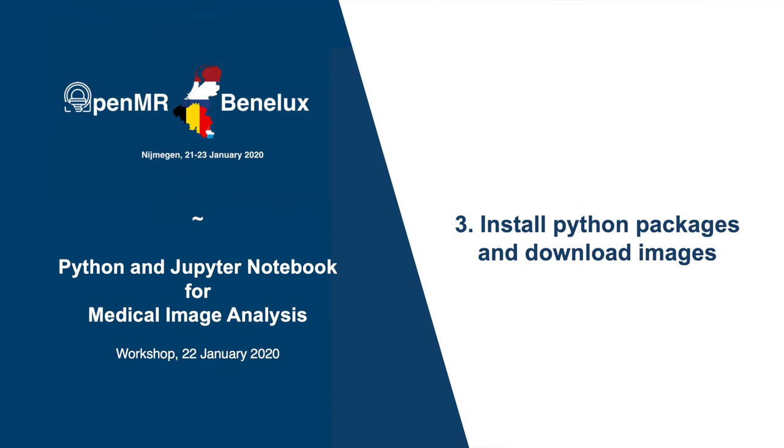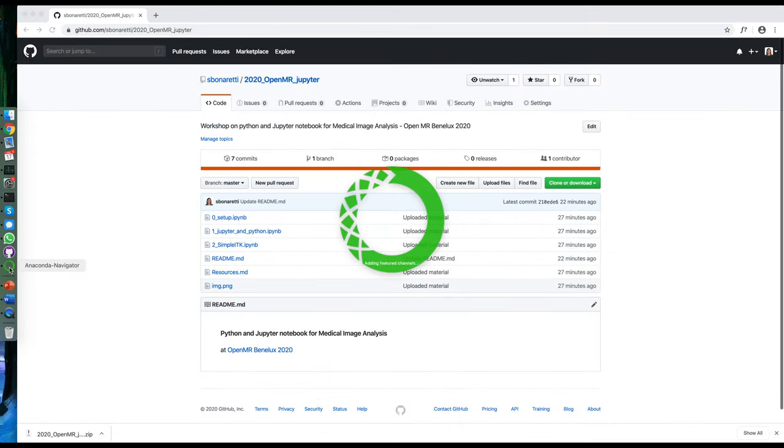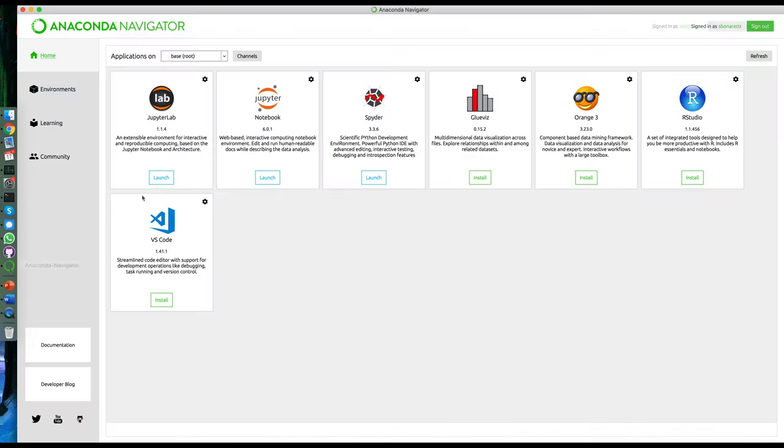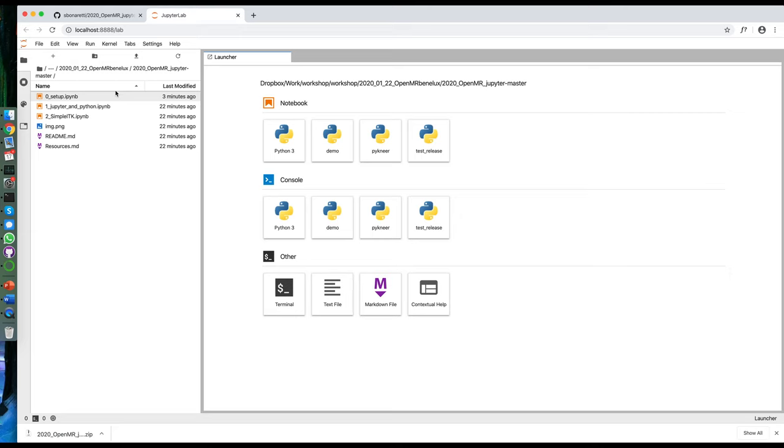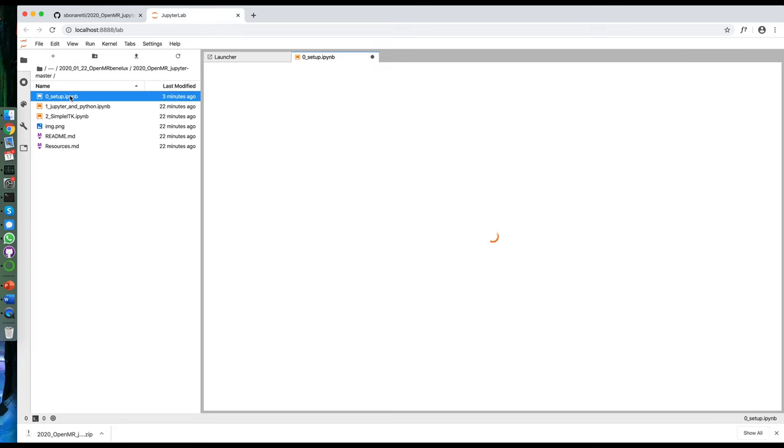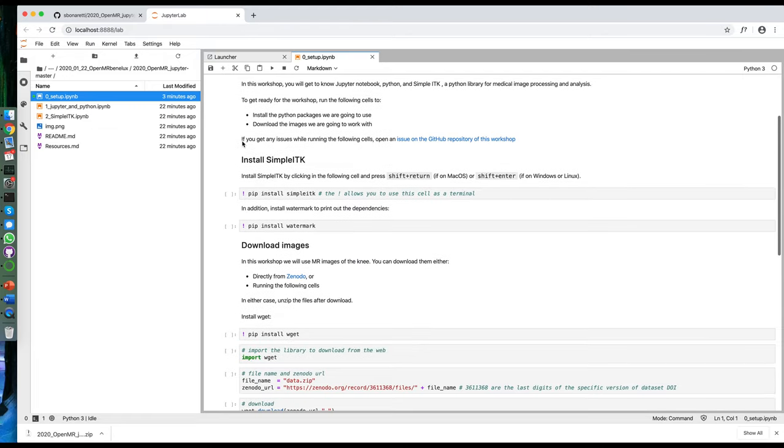The third and last thing to do is to install a few Python packages that we will need and download the images that we will use. To do so, open Anaconda and launch JupyterLab. Navigate to the folder you downloaded from GitHub and double click on the file zero_setup to open it.